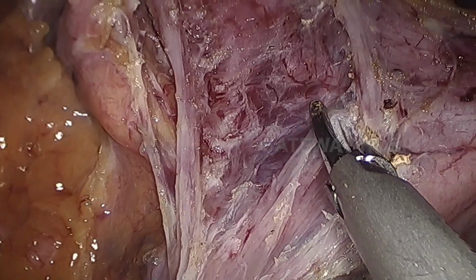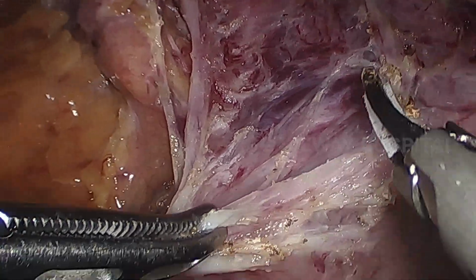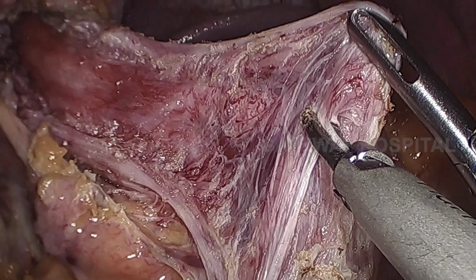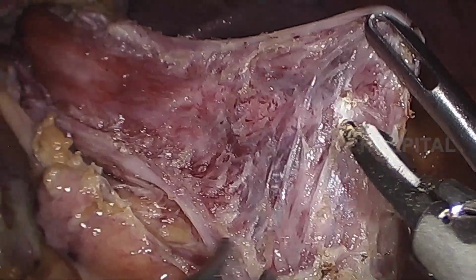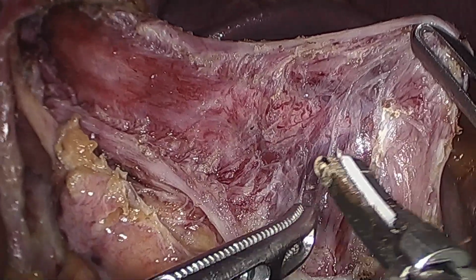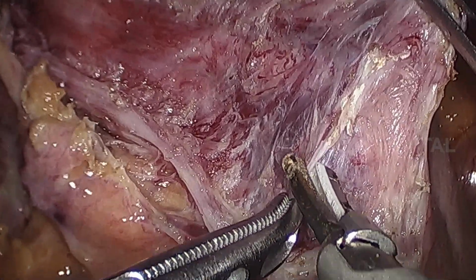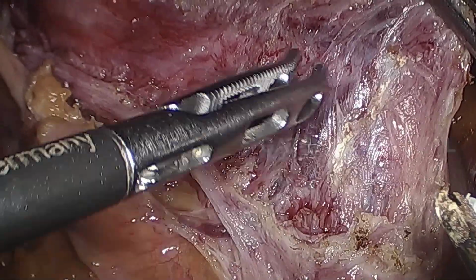If you tear this vessel, there will be profuse bleeding. If there is any bleeding, you should not use an energy source to control the bleeding. What you can use is a gauze piece, keep it over it and compress it. Most of the bleeding will settle down. And sometimes if you want, you can put a suture to control the bleeding. Because if you use a bipolar to control, there may be a chance of delayed leakage or delayed perforation.